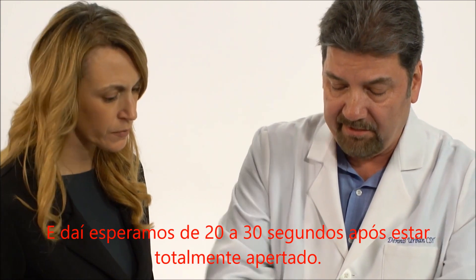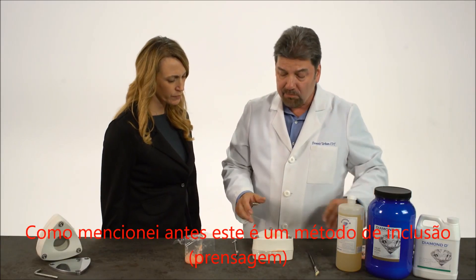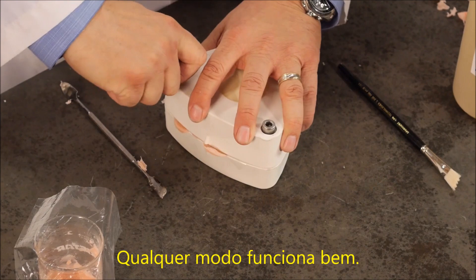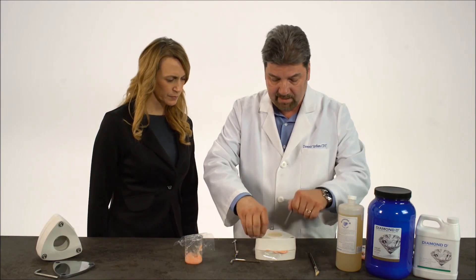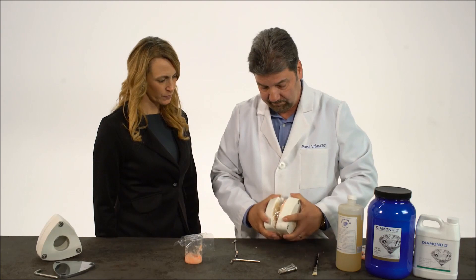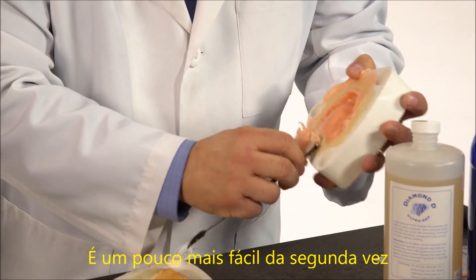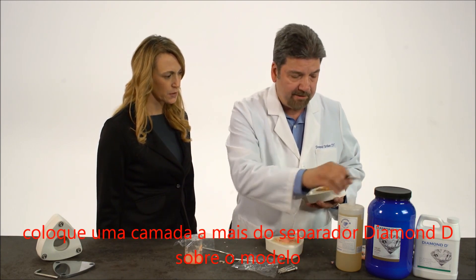I'm going to wait 20 to 30 seconds after it's tightened all the way. As you can see, the excess is coming out of the sides. This is one method of packing. The other method is utilizing the metal plate with a compress or a press, or a pneumatic press — either way works fine. I'm going to open it once more, take the bolts out. That's what you want to see — nice and shiny. We'll start taking the rest of the excess off. Make sure you take any excess out of the holes where the screws are going to go. Now we're going to put one more coat of Diamond D separator on the model.